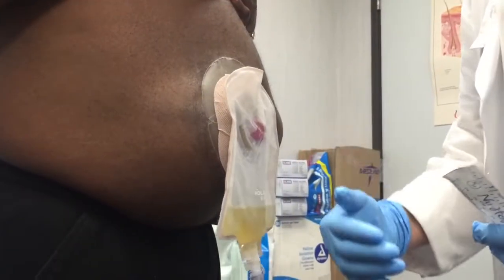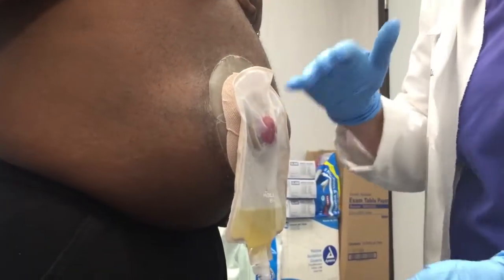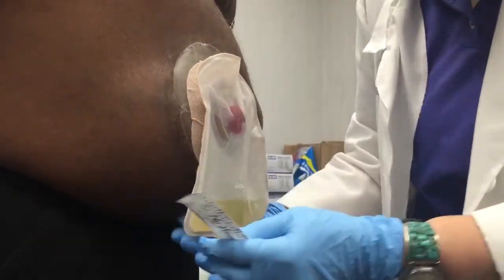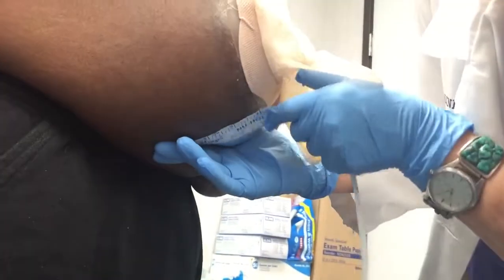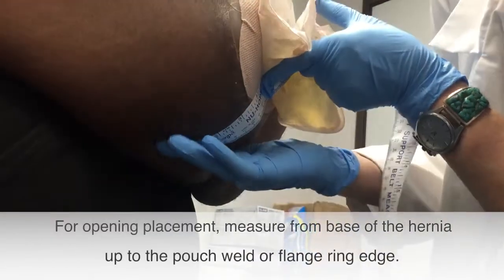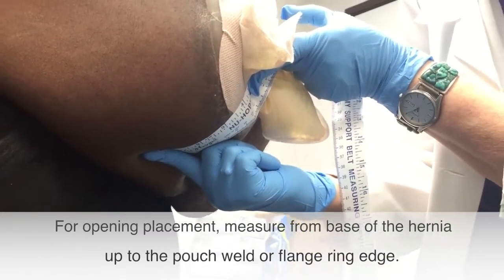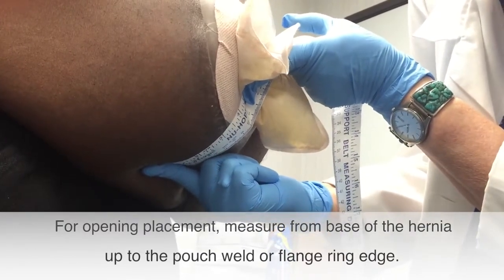While he's standing, it's important to determine where the opening in the belt will be placed, because if it's too high or too low, we may not get the proper support. I usually get near where you want this hernia supported and measure up. Measuring up, I get about four and three-eighths inches from the bottom of the belt.